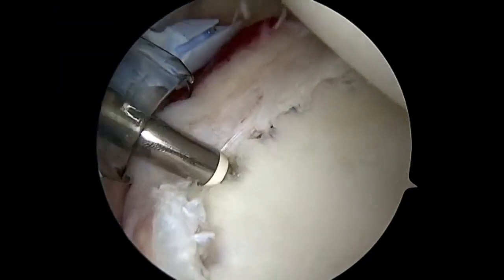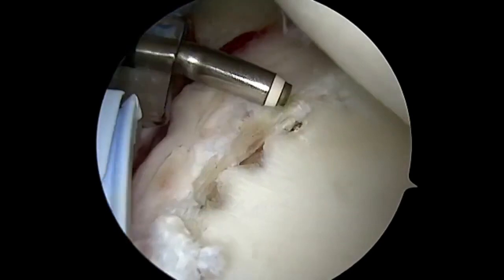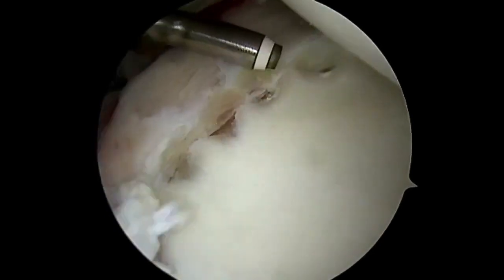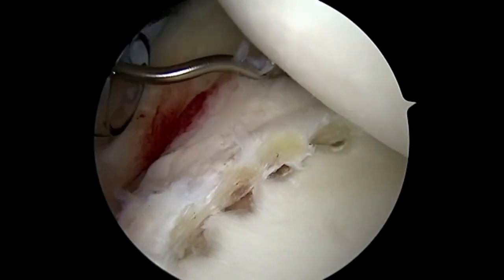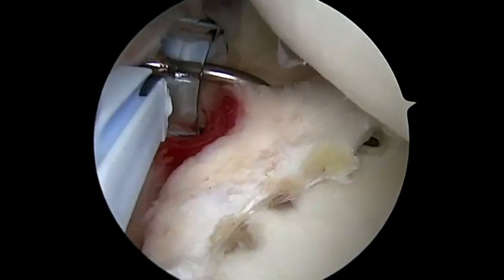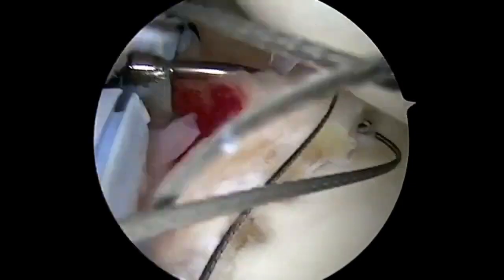Next, we'll bring in the small ablator to clear the soft tissue from the drill holes. This will enable us to identify these holes when it's time for anchor placement. A curved suture passer is then used to take a bite of capsule inferiorly. We're going to shift it superiorly and then come out underneath the labrum.